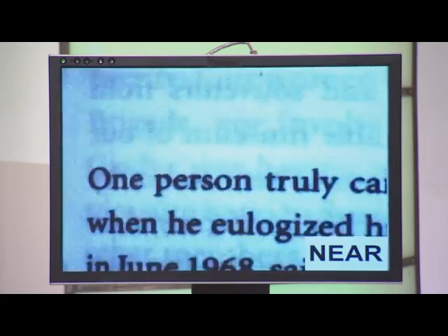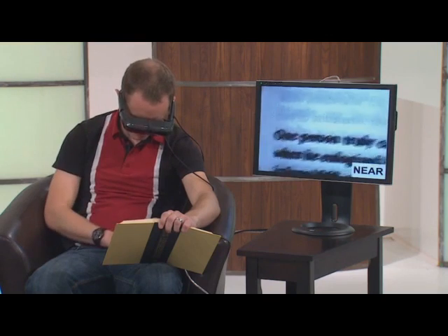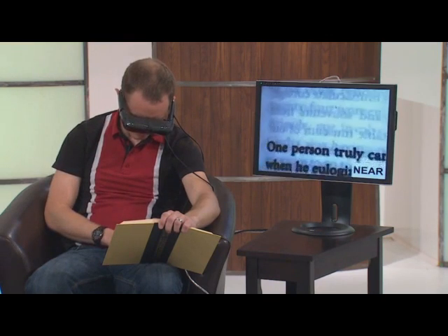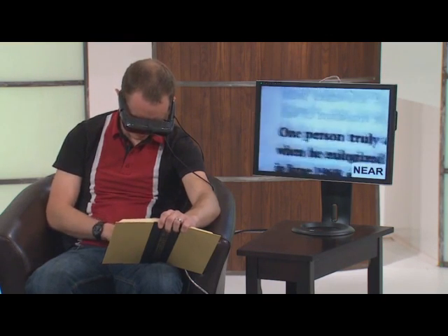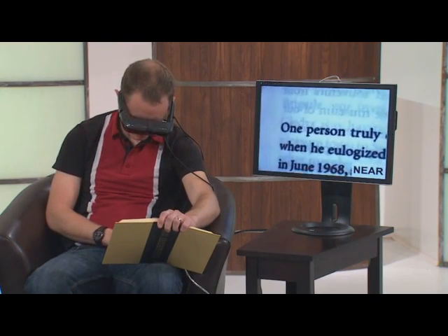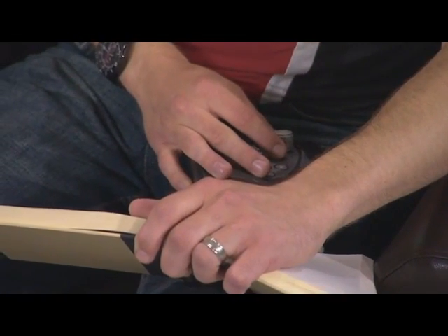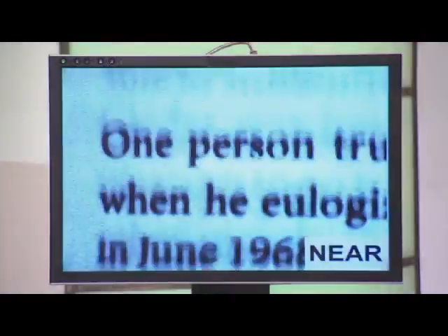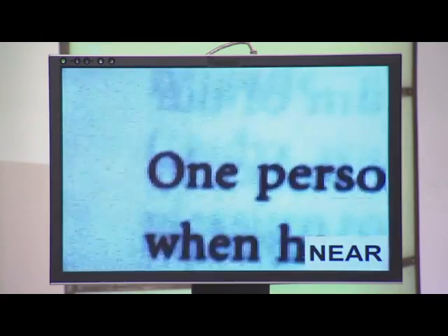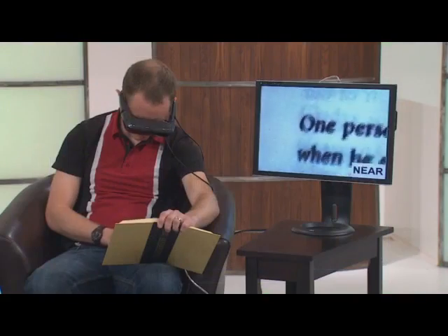I'm holding it, I think it's about 2 feet away from my face now. It's on my lap. My arms are extended, whereas before they were all crunched up. And I'm sitting upright, so I don't have to hold the book and hold the weight. The weight is taken by my legs now, so it's a lot more comfortable. And as we can see on the monitor, it's completely clear. Yeah, I can zoom in quite a bit, actually. Here's one word, the word one, actually. It fills almost the whole screen.